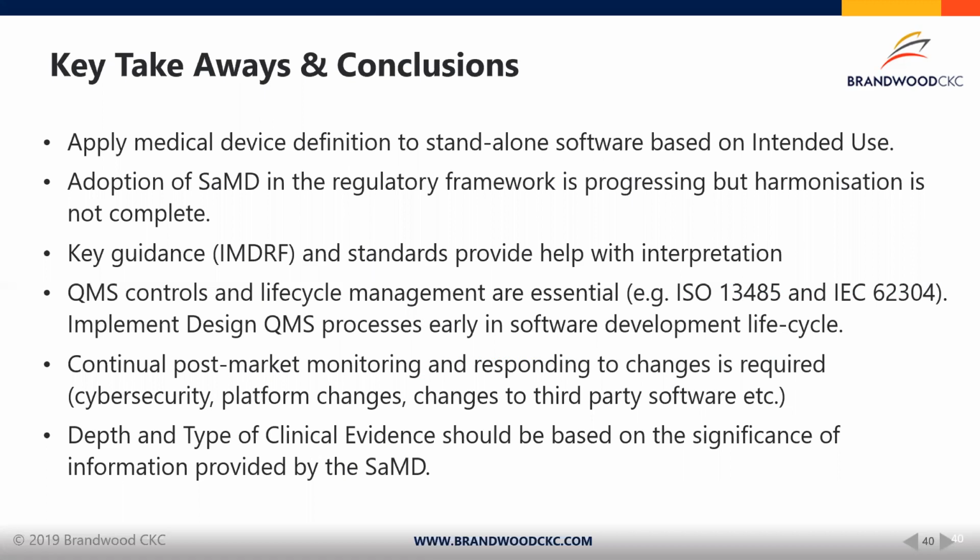Post-market monitoring, I think we stressed that throughout the presentation. This is something which has to be continual and responsive to changes. So, for example, aspects of cybersecurity, changes in platforms, and changes to third-party software are the kind of factors that have to be considered on a continuous basis to evaluate the impact on your state of validation, but obviously also on the intended use of the product and on the nature of clinical evidence and the regulatory clearances and approvals that you may be holding. And the depth and type of clinical evidence should be based on the significance of the information provided by the software as medical device.